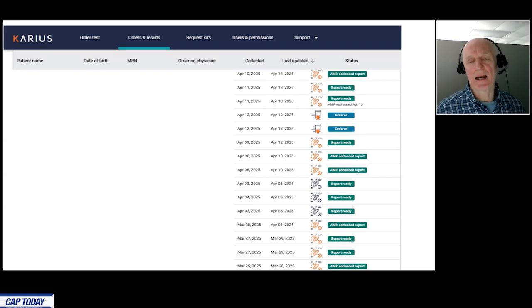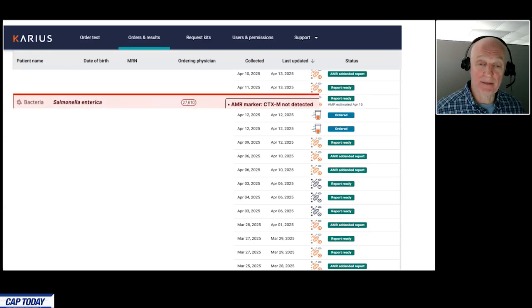So if we just look at these top 3 patients from the week prior, when I took this snapshot, you can see patient number 3 from the top had an organism detection in less than 48 hours. And there's a footnote on the status of the report indicating that this organism does warrant screening for genetic markers of resistance, and that result will be forthcoming in 24 hours. That patient actually had very high level of Salmonella enterica, which did grow in the blood as well.